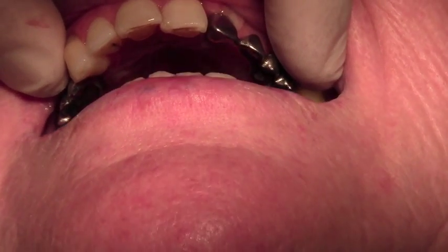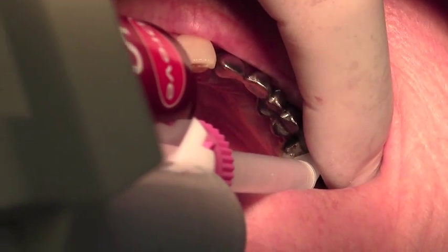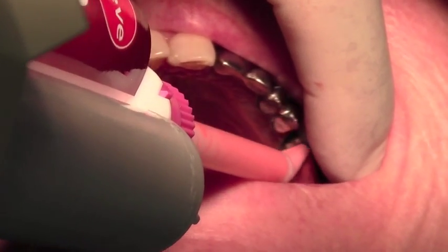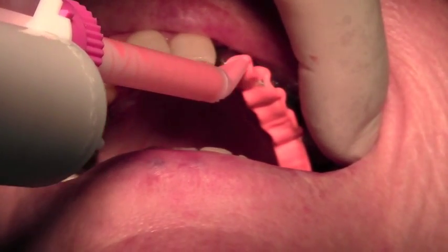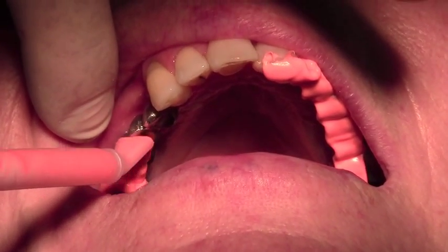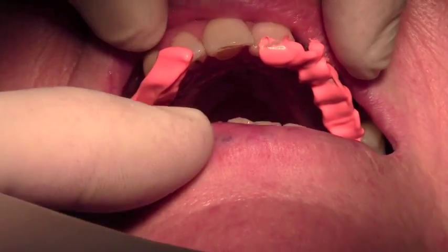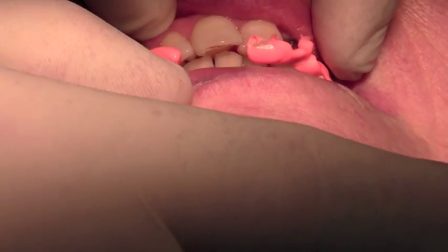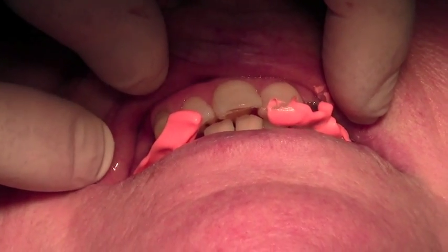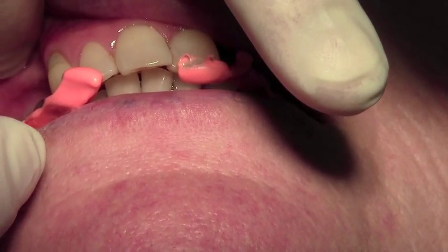The final bit we need to do now is a bite registration. For this we're going to use a stone bite, and I'm just going to gently pipe that onto our bridgework on the left side, a little bit more onto the right side, and if you bite firmly together for me — we verify that's correct, and then we just let that set for a couple of minutes. Now that that's set, we're going to remove the metal work with the bite registration. Just stretch open for me.